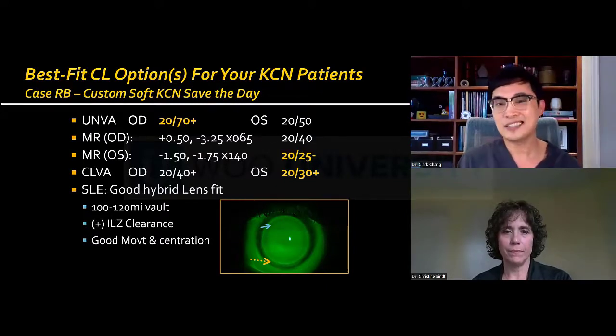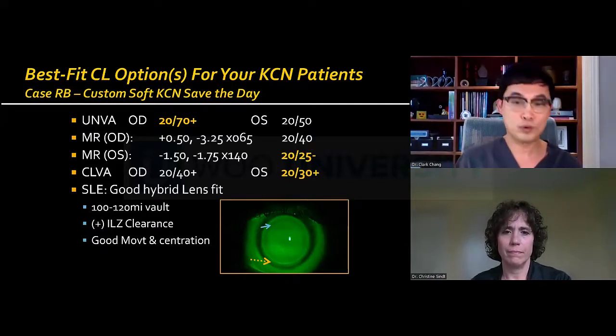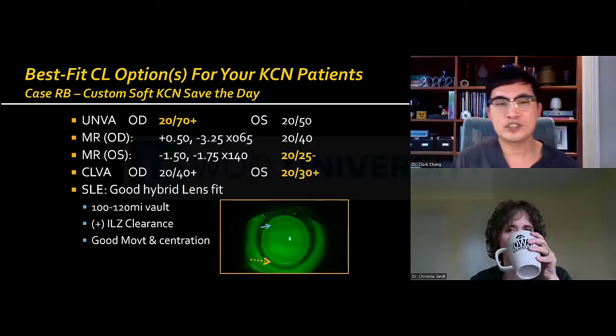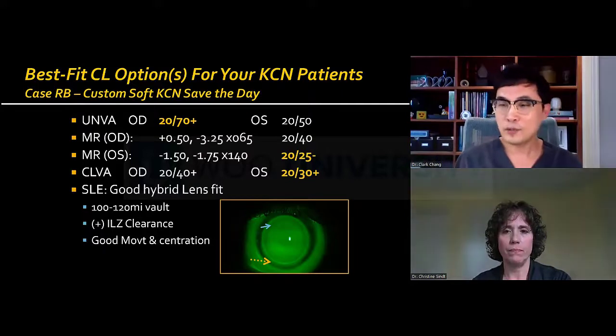And the patient says, again, it's the same thing. It's comfortable. I wear them all day long now, but I find myself going back to glasses because, if anything, I think the vision is actually worse than my glasses in the hybrid lenses. And that's really odd again, why would that be? Well, maybe if you look at the contact lens vision, a few letters less in the left eye, which I think he's probably paying much more attention through. I don't know why that is. You would think that with the corneal GP that should be largely taken care of in both left and right, or at least in the left eye.